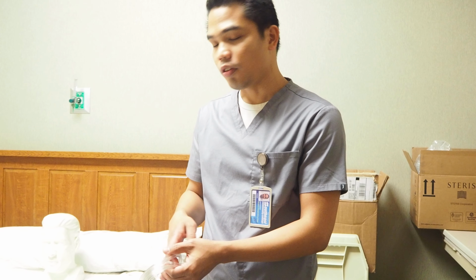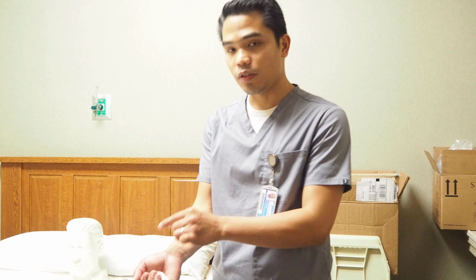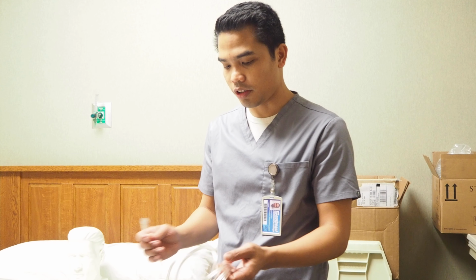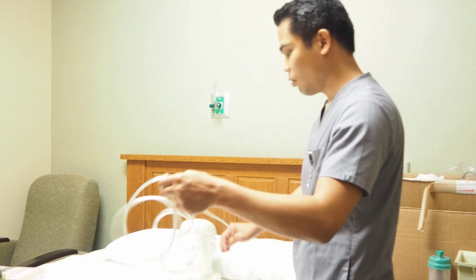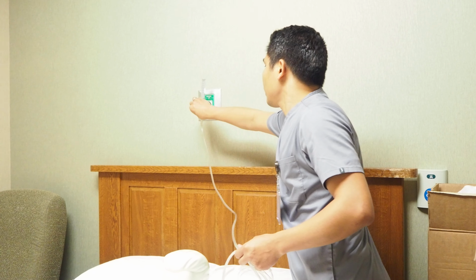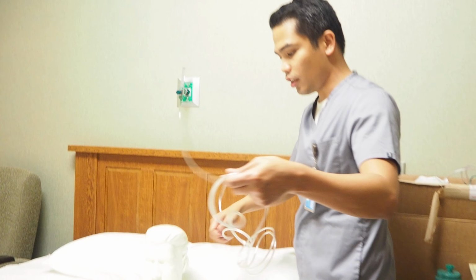And then I will always do my pre-assessment, obtain vital signs, and check the ID band to ensure the patient is the correct patient for confirmatory purposes. After that, I hook this to the patient, ensure there are no kinks, and turn it up to the desired flow that the doctor would like, which is 3 liters.